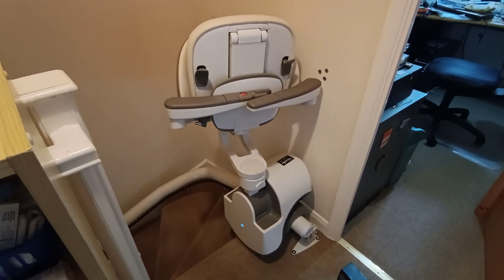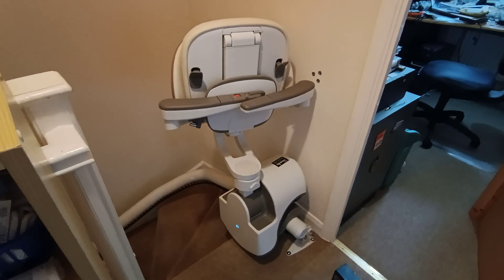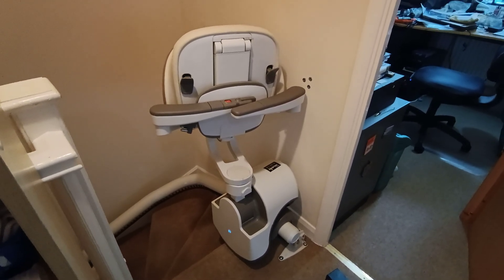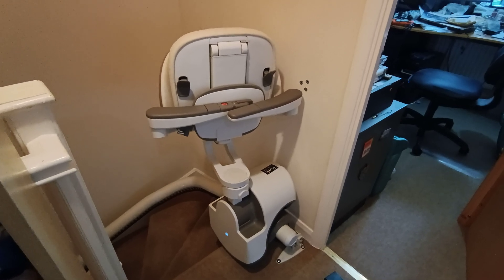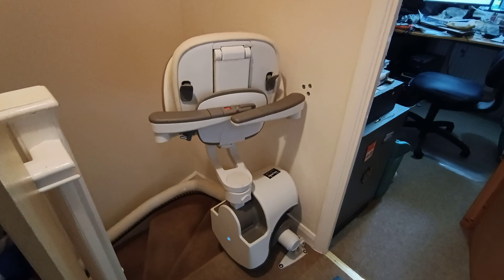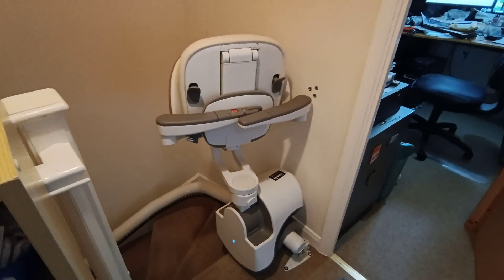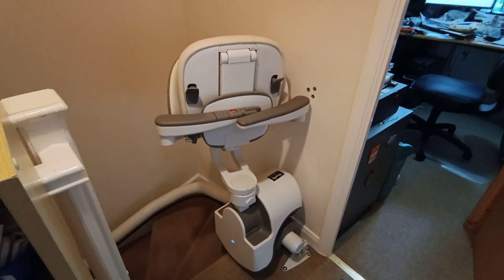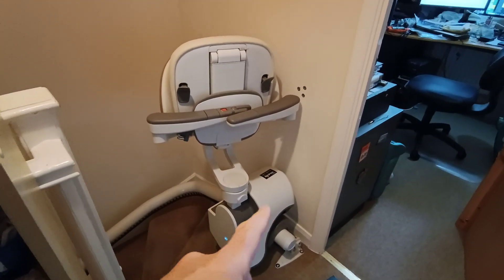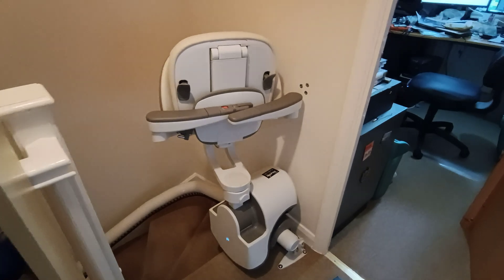Hello, welcome to my video on troubleshooting and battery replacement of the Tyson Krupp Flow X stairlift, also known as the AXS BDD Flow X stairlift. It's the next generation to the Flow 2 as I understand it, and as you can see this part of it is fairly similar to the Flow 2.